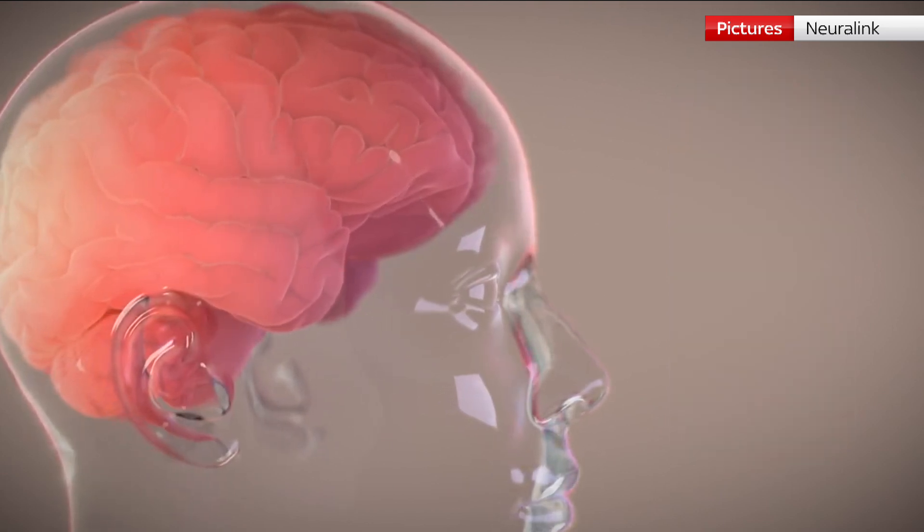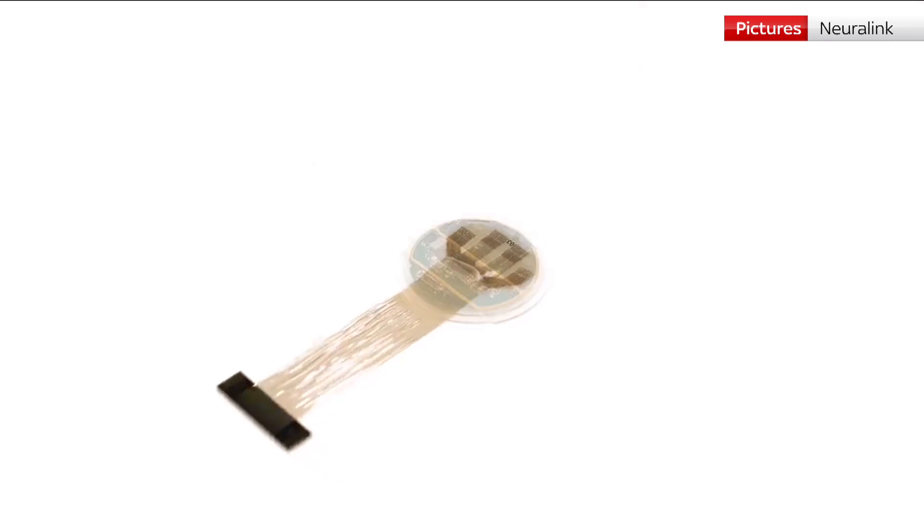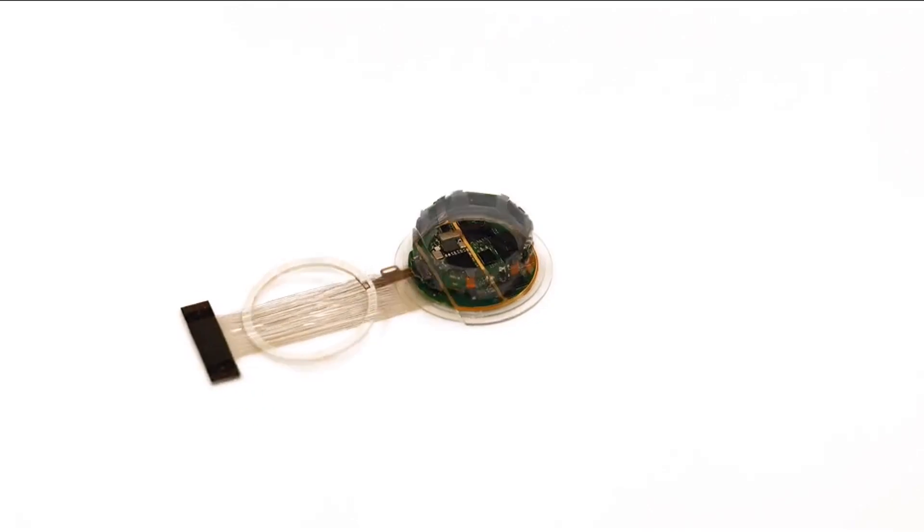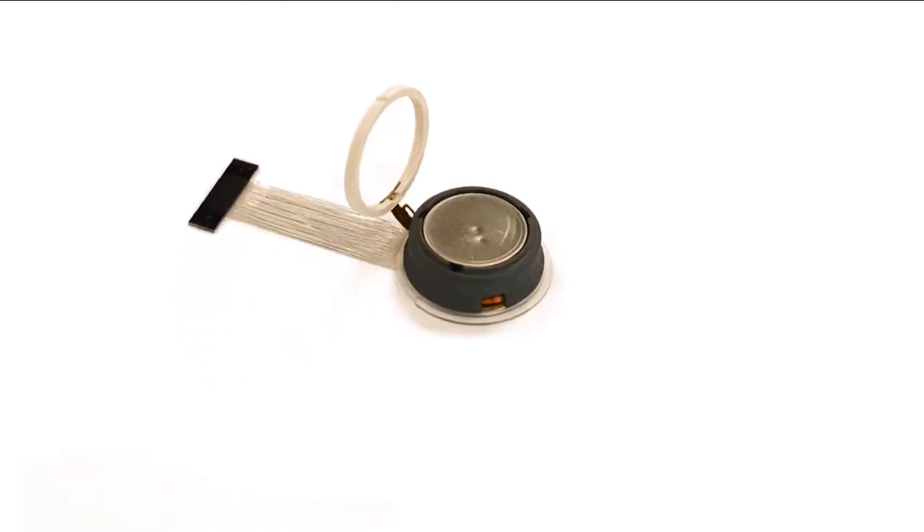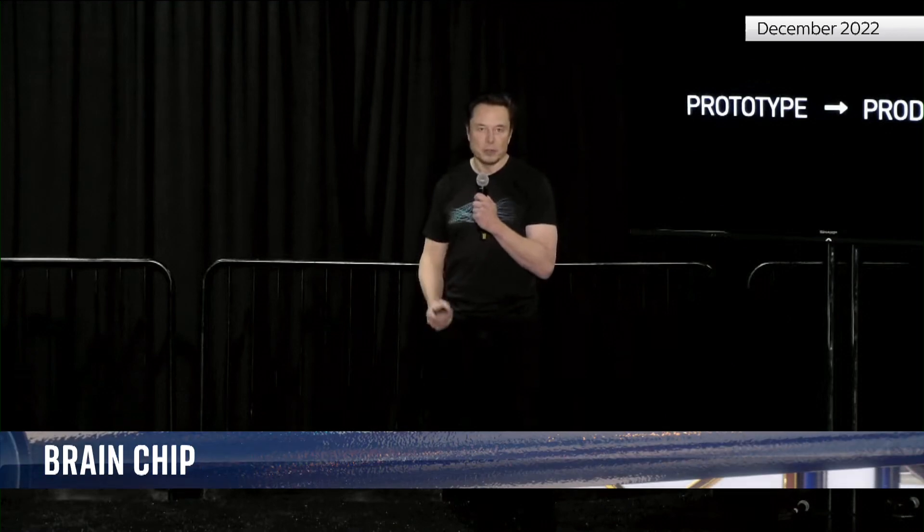For eight years since founding Neuralink, Elon Musk has been wanting to get inside our heads. We think probably in about six months we should be able to have our first Neuralink in a human.